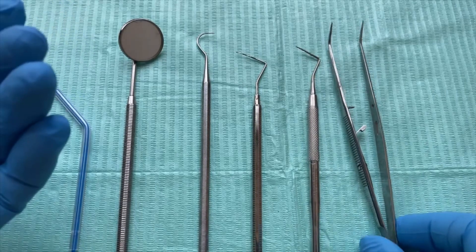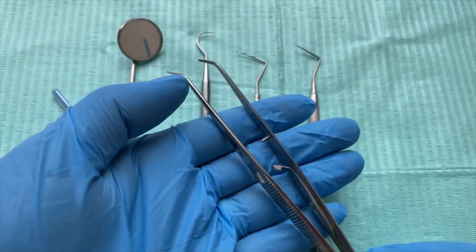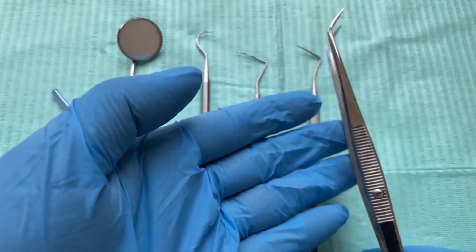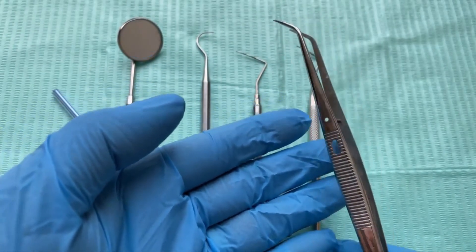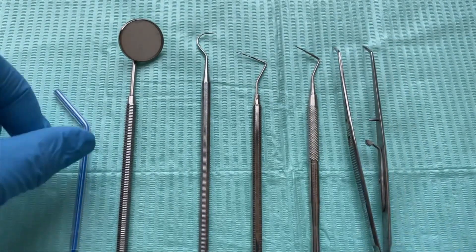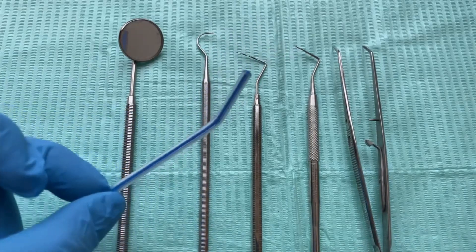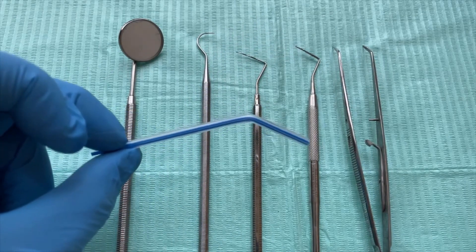And this is your tweezer, or a cotton plier as other countries call it. And then you have your three-in-one tip — this is used to dry the tooth surfaces.